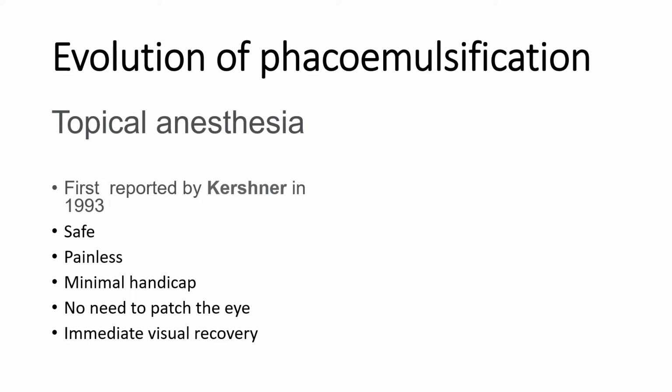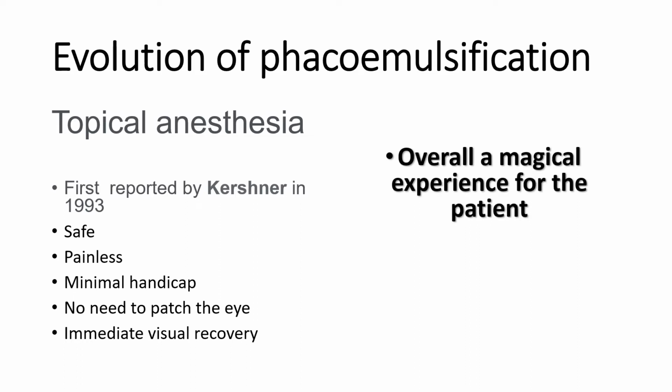So there is no need to patch the eye because the lids are functioning, and there is an immediate visual recovery. These features have made this a magical experience for our patient. The patient goes into the OT and gets operated, it takes about 10 to 15 minutes, and when he is out he can actually see better.